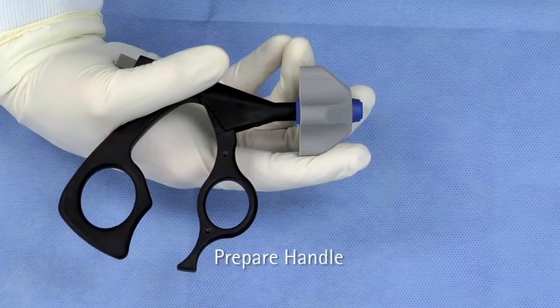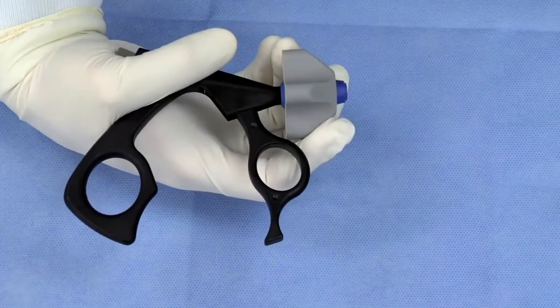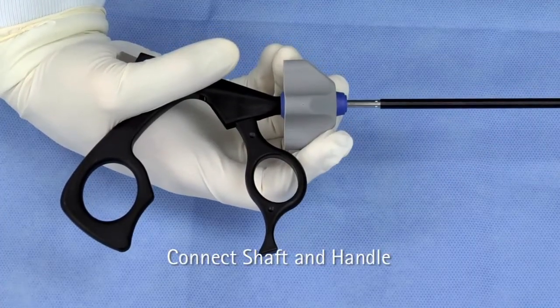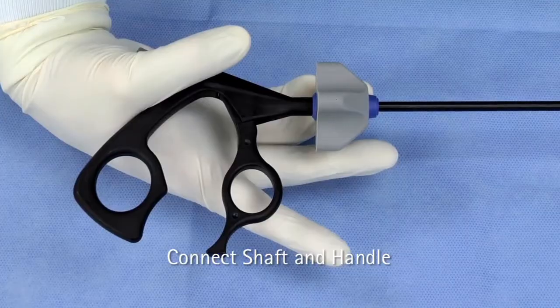Pull the rotation knob back and hold it. Bring the movable handle component into its forward position. Hold the jaw insert at the tip and push it into the handle. Release the rotation knob, which moves forward. Do not touch the movable part of the handle.